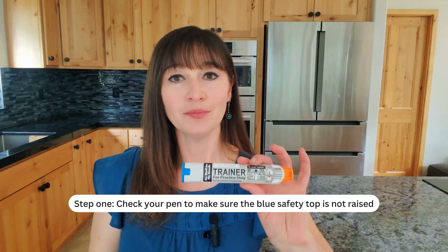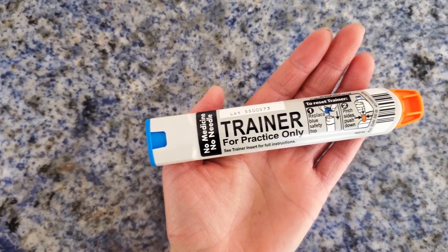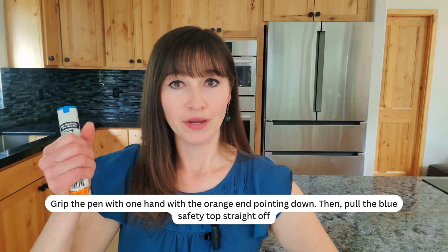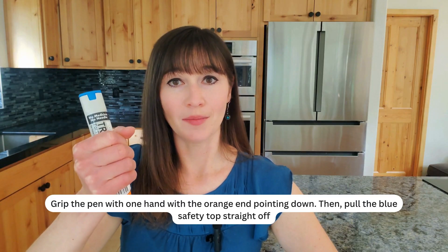Step 1. Check your pen to make sure the blue safety top is not raised. Grip the pen with one hand with the orange end pointing down, then pull the blue safety top straight off.